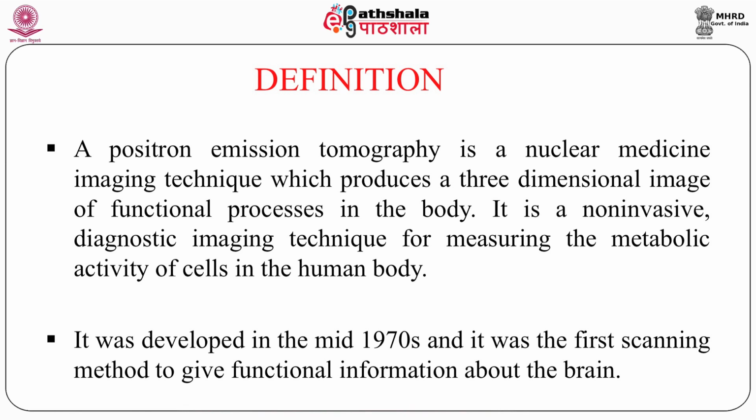It is again a non-invasive diagnostic imaging technique for measuring the metabolic activity of cells in the human body. That is the reason the things which we cannot detect at the organ level or tissue level, there is a chance that you are able to get the same thing at a cellular level. So this is the imaging technology of today's era.